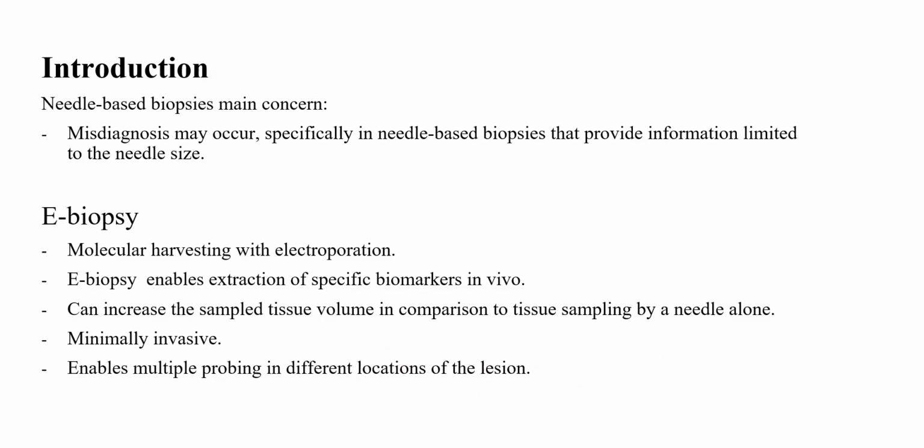A major concern in tissue biopsies with a needle is missing the most lethal clone of a tumor, leading to a false negative result. Needle-based biopsies gather tissue information limited to the needle size. In this work, we present E-biopsy, a minimally invasive technique which enables molecular harvesting using electroporation. This study suggests that E-biopsy could increase the sample tissue volume in comparison to tissue sampling by a needle alone.